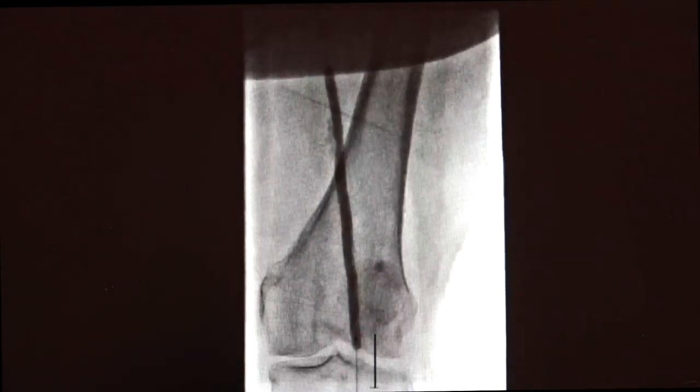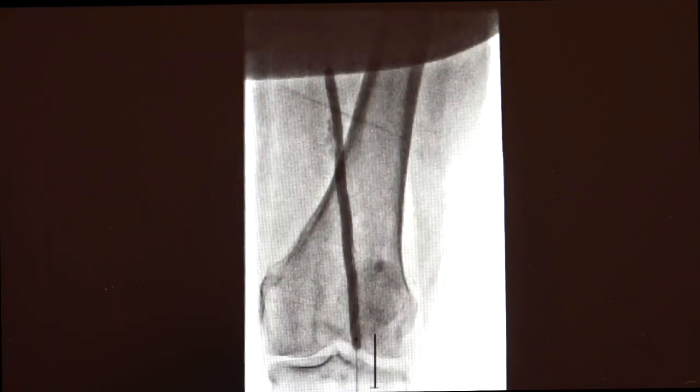Working more proximal into the popliteal and the SFA, we started to make some progress. There was some element of dissection, and we wanted to treat this more effectively. We used an Impact Admiral drug-coated balloon — a 6 by 150mm — to open this up better. We were starting to make progress, but there was still some residual stenosis into the popliteal and concern for dissection, making it evident that this patient would be best treated with a stent.